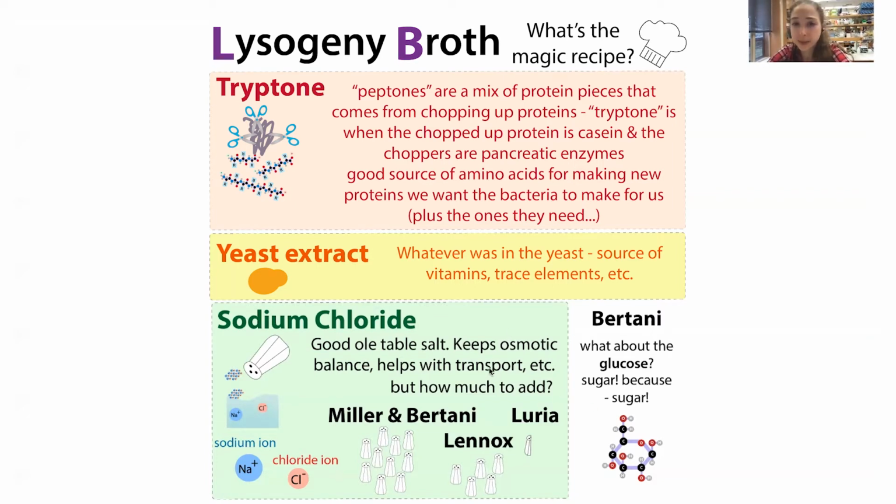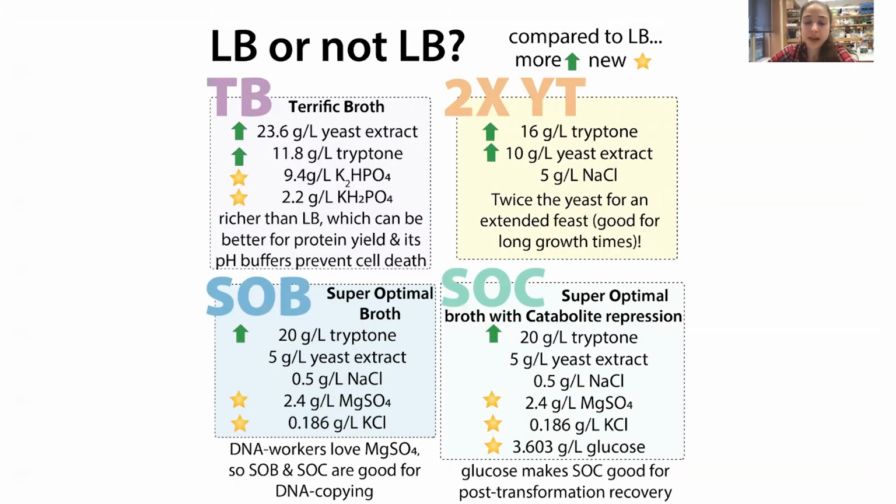So you've got the protein pieces, you've got the vitamins, minerals, that sort of thing. You've got salt to keep with the osmotic balance, help with the transport, etc. And then in some cases you have the glucose. That's the basic formula, the basic media that is the groundstone of a lot of what we do. When we're doing normal types of work in molecular biology, biochemistry, whatever, that's the go-to.